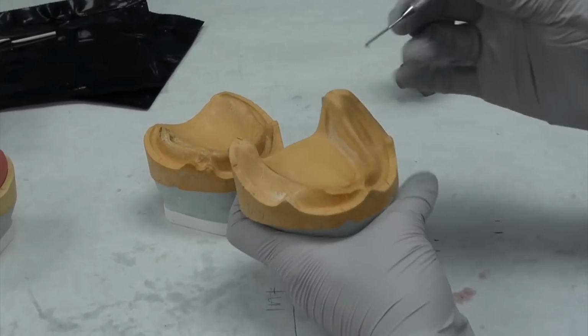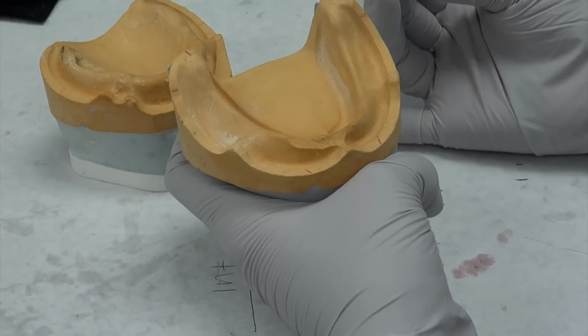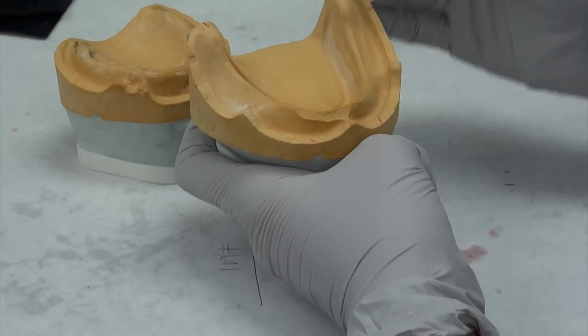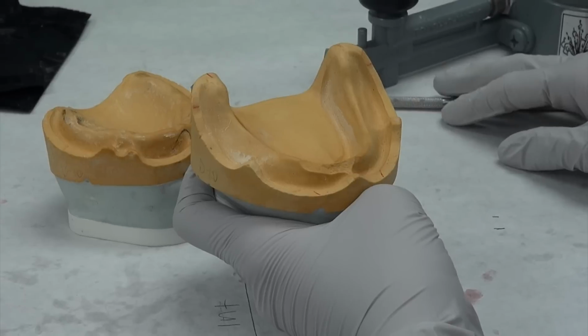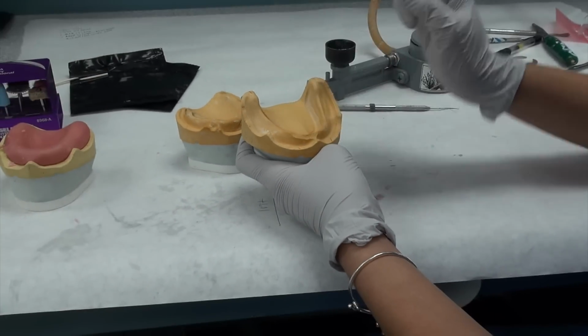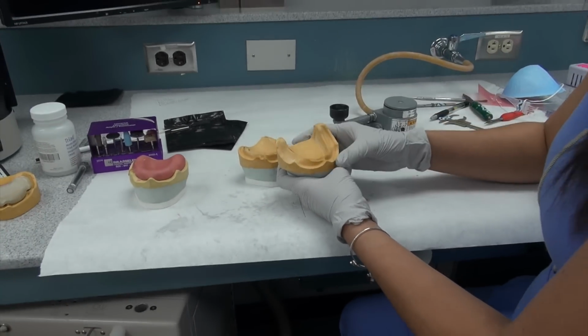Another thing you want to take note of, if you look right here, you can see that it is fractured. This is actually a cast that I have done multiple practices on, and if you do not properly put MRA in it, it will fracture, and that's because the stone and the triad adhere to each other.